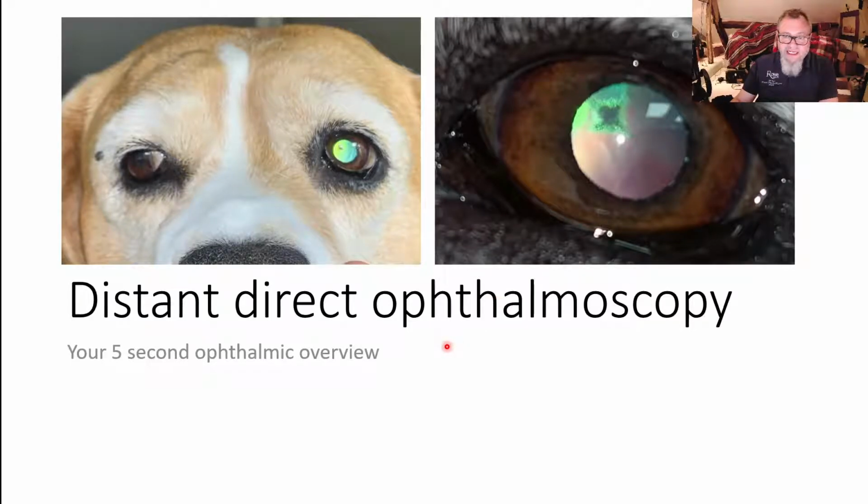So the first technique we're going to talk about is distant direct ophthalmoscopy. This is one of the most useful techniques in ophthalmology. It really is your 5-second ophthalmic overview. In every case you see, regardless of its presentation, you should be doing this technique. This should be quicker than auscultation, and give you lots of information.